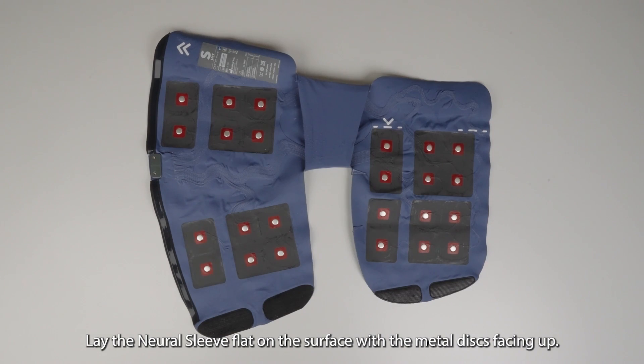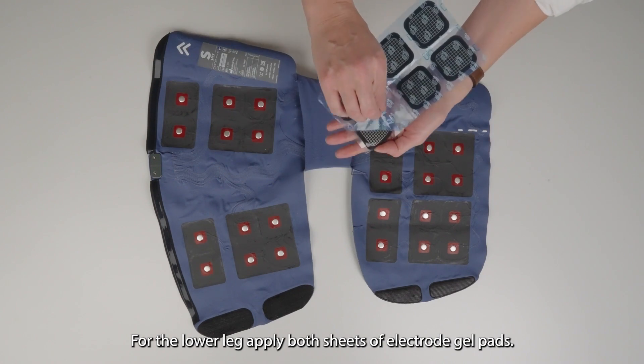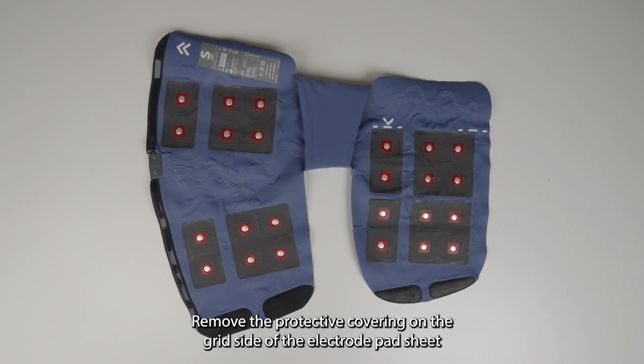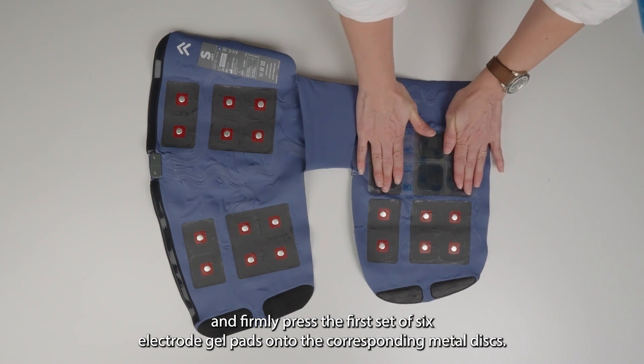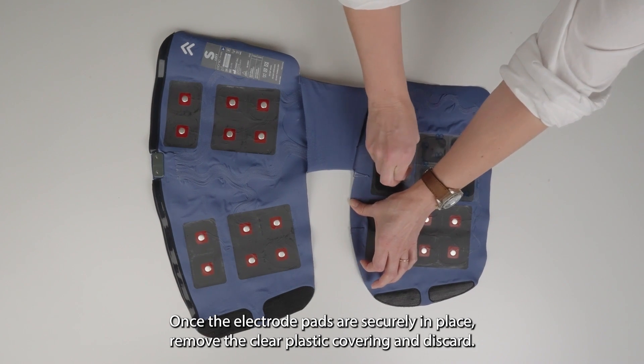Lay the Neural Sleeve flat on a surface with the metal discs facing up. For the lower leg, apply both sheets of electrode gel pads. Remove the plastic film on the grid side of the electrode pad sheet and firmly place the first set of six electrode gel pads onto the corresponding metal discs. Once the electrode pads are securely in place, remove the clear plastic covering and discard.